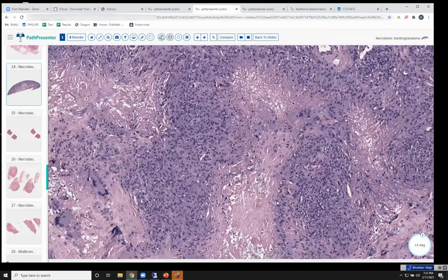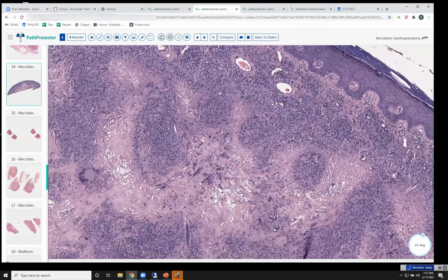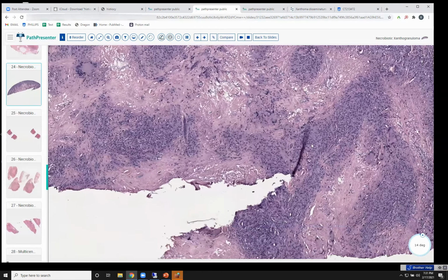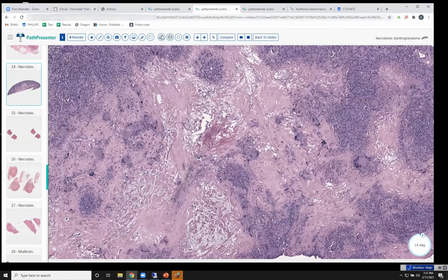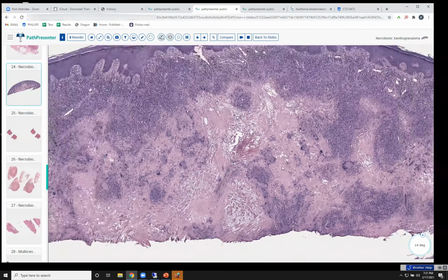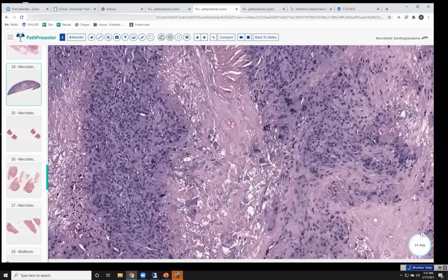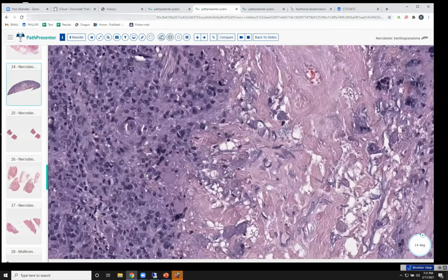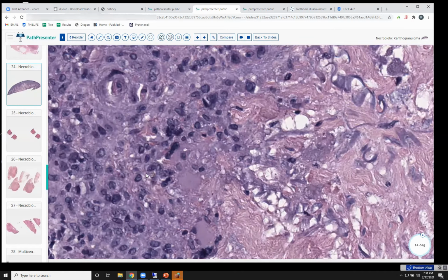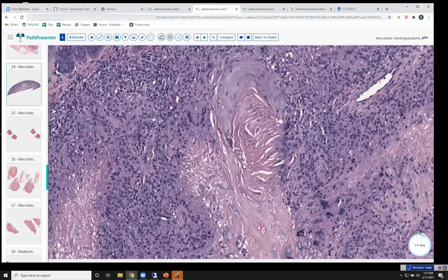And often in this disease, very, very dense lymphoid infiltrates, which I'm not seeing in this as well as in some of them. But these cholesterol clefts with necrobiosis are absolutely characteristic of a necrobiotic xanthogranuloma. So you've seen xanthogranuloma, you've seen reticular histiocytoma, you've seen Rosai-Dorfman, you've seen necrobiotic xanthogranuloma. All have got diagnosable histology, this cholesterol clefting.